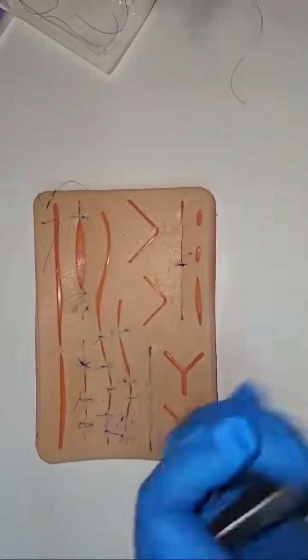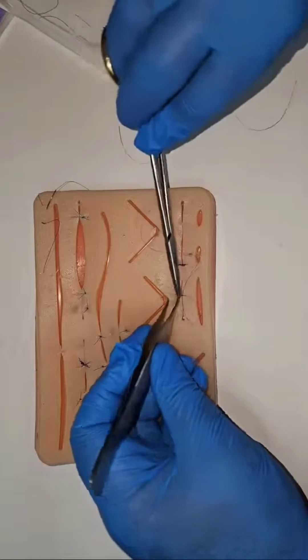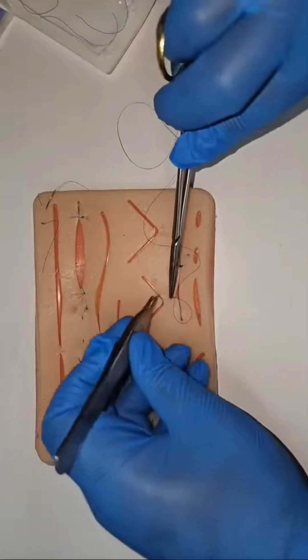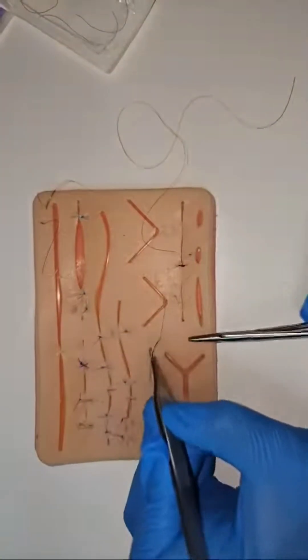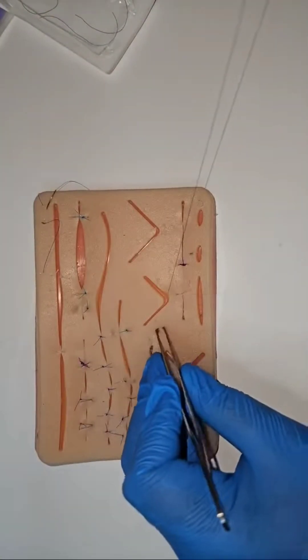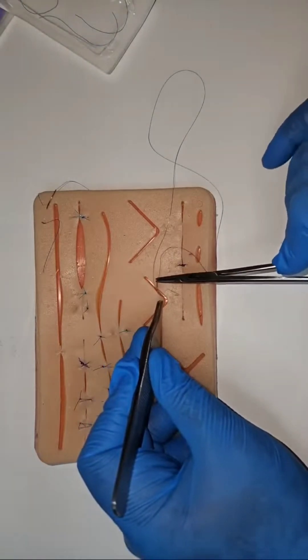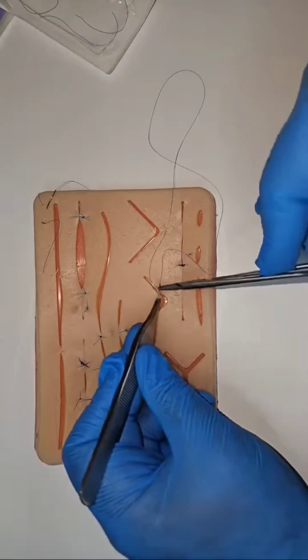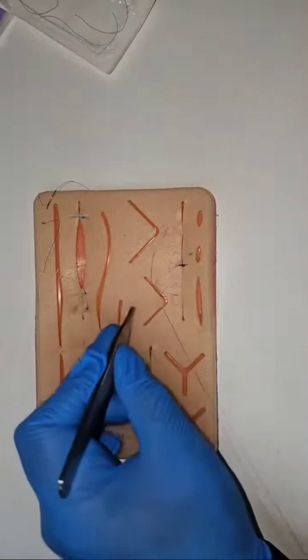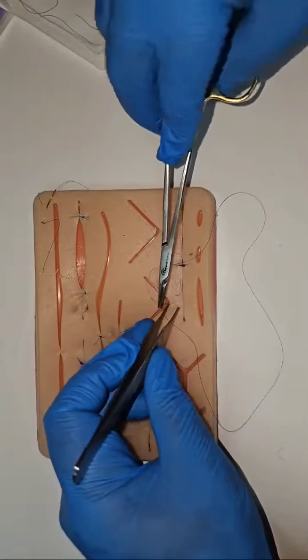The horizontal mattress starts at the side of the apex. You're going to take a subcuticular bite in the skin flap — subcuticular being as superficial as possible, above the fat in the dermis, but you can't see the suture on top. And then you come out just here.